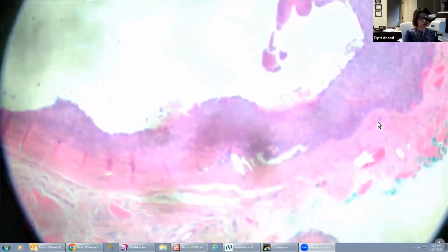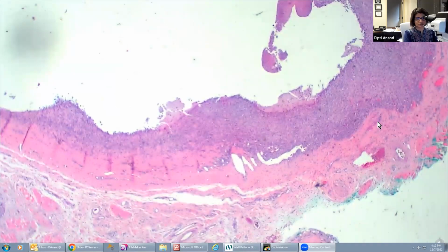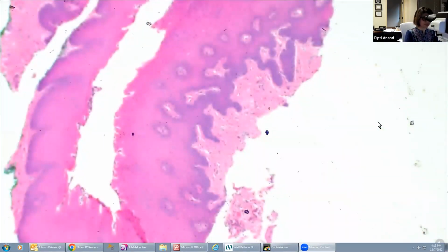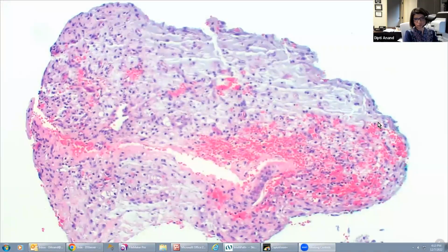When you have all the features, you have the mucin, you have the inflammatory response, and it's easy to make the diagnosis. In some other entities, it may be a little bit more difficult because you may not see mucin, which is obvious. So this is, again, you see that this is the mucosal epithelium. So you can see the nice mucosal epithelium, the salivary gland tissue. And here you do have the adjacent mucin. So that's, again, simple and straightforward without the inflammatory response around it. So that's a mucocele.